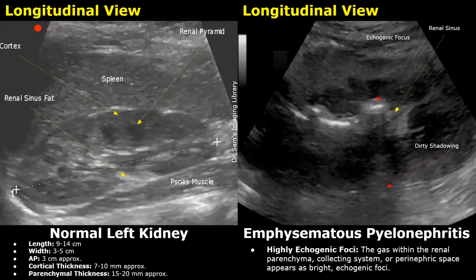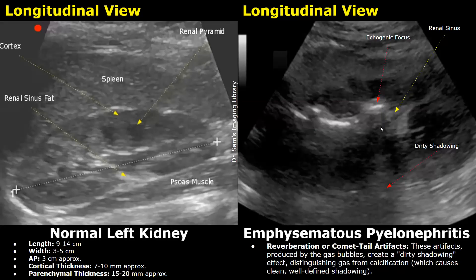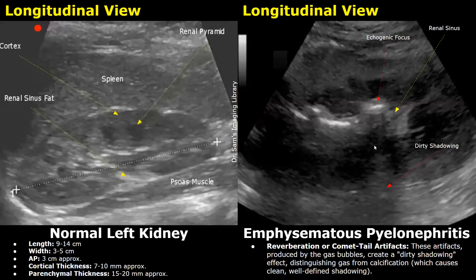Emphysematous pyelonephritis is a very serious condition in which gas forms within the kidney. On ultrasound, you may find highly echogenic foci within the kidney followed by dirty posterior shadowing. This dirty shadowing appears gray in color instead of black. The black shadow is seen behind stones, whereas a gray colored shadow is seen behind gas. These echogenic foci with dirty shadowing indicate the presence of gas within the kidney.